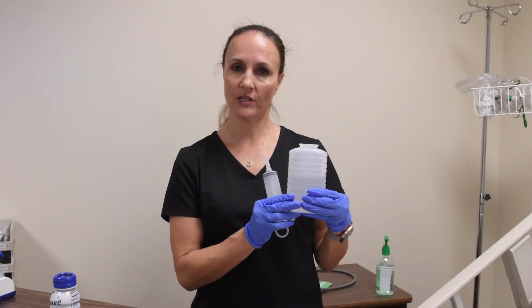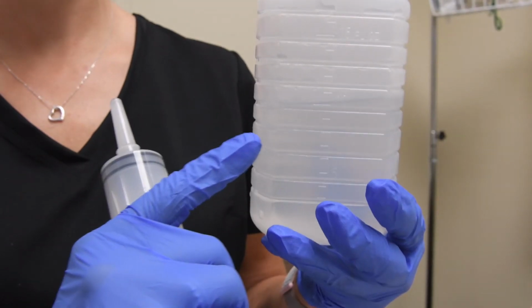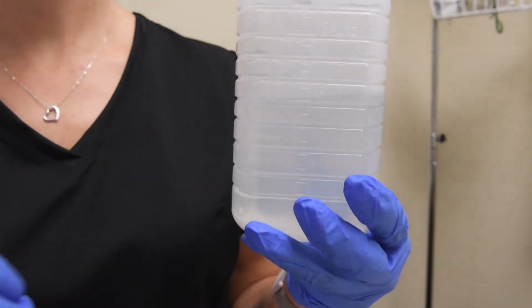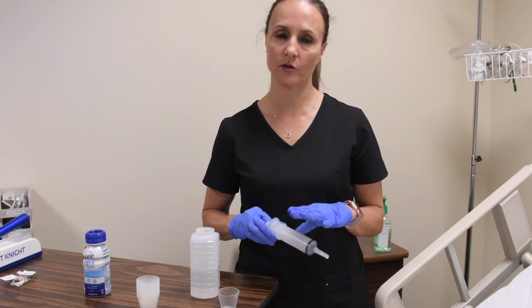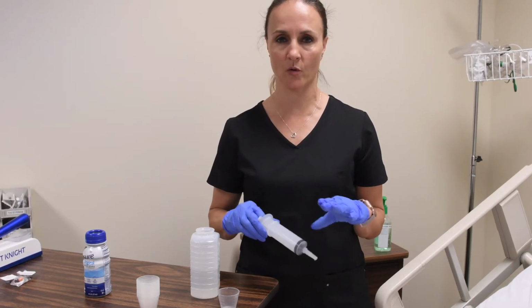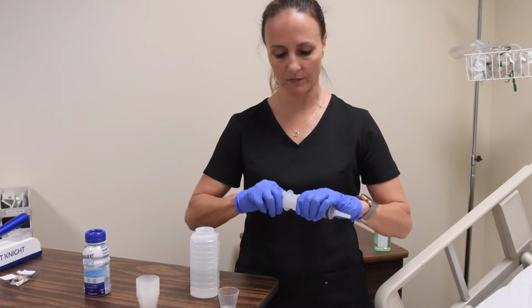I have filled my irrigation kit with my tap water, which is tepid warm water. I have filled it up to the 300 mark, so that is my beginning count. Before I begin, I need to flush the PEG tube with 30 to 50 mLs of the warm tepid water to make sure that it's patent. Best practice is to do this by gravity.